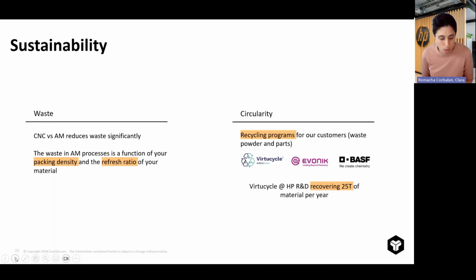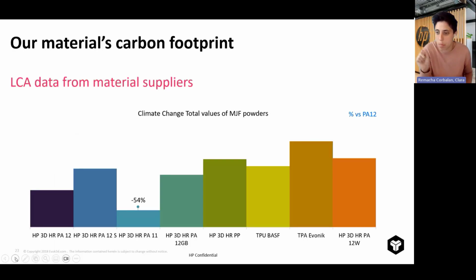And then the last thing that I wanted to explain is also touching on sustainability. When you decide which material you want to use, another criterion that you can use is the carbon footprint of the final part that you will be producing. To understand the carbon footprint of the different materials, if we move on to the next slide, I'm going to go pretty quickly and keep it simple, but these are the things you need to take into account to calculate the carbon footprint of your final part, depending on the material.